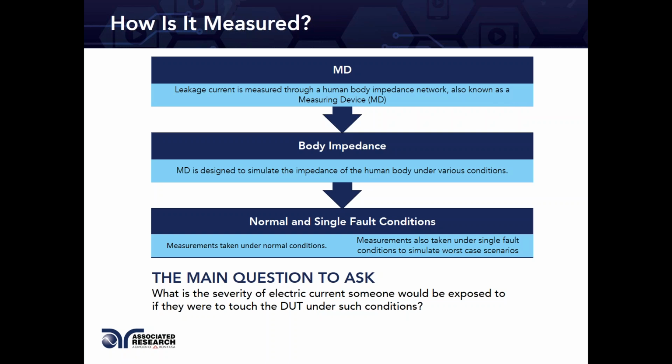Let's say you make 10,000 products a year. One of those products that went out in the field was hooked up to an ungrounded outlet. Now, are you ensuring that the leakage current felt by the person coming in contact with it does not exceed 5 milliamps, 10 milliamps? These are some of the levels that people start feeling strong reaction to electrical current.